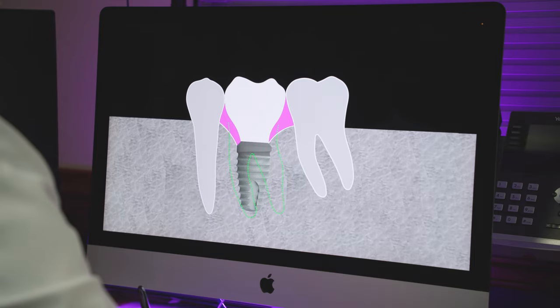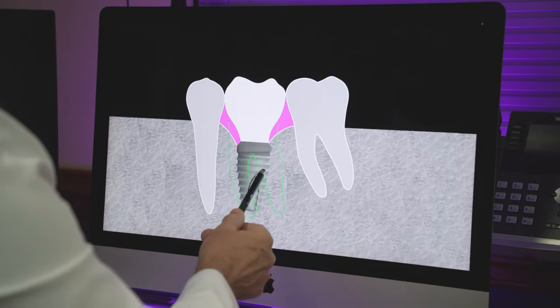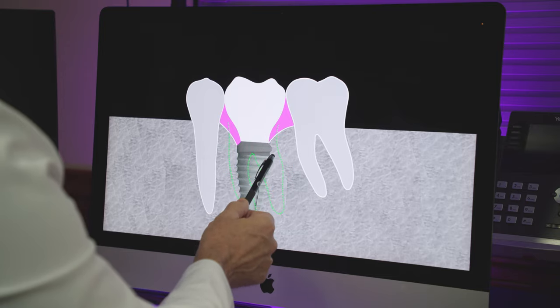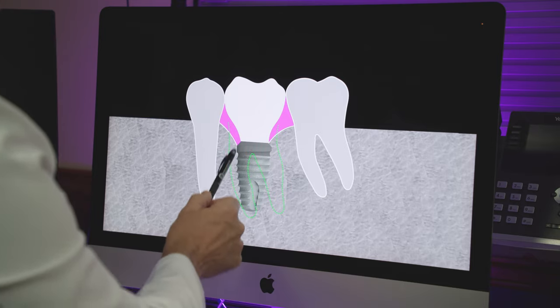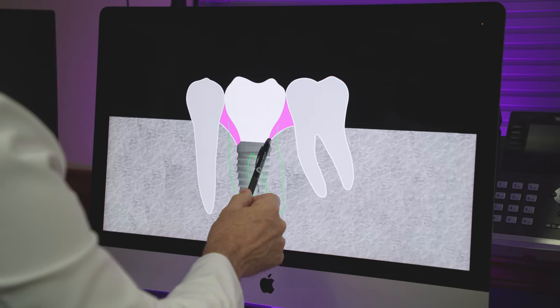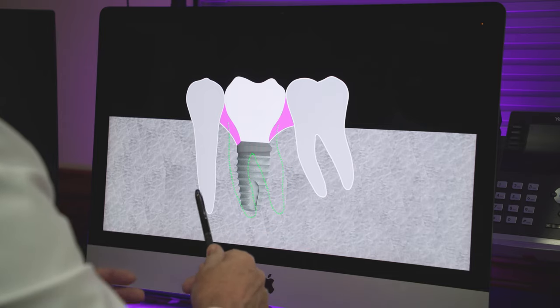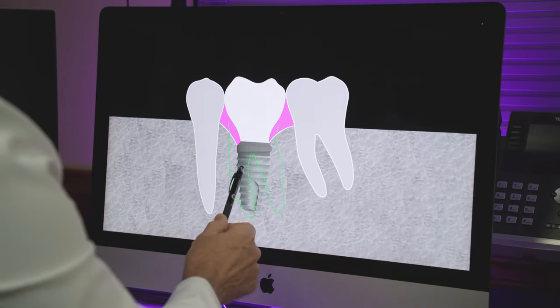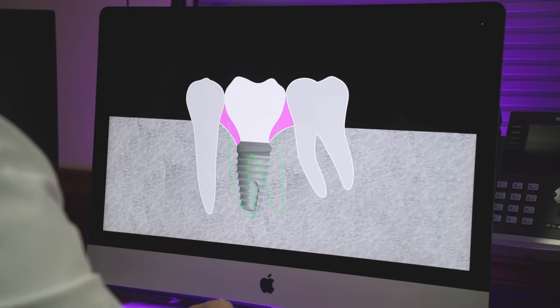Now, if we superimpose the original socket that the tooth went into, it would look like this with a green dotted line. This is very important: when we place this implant, this area had no bone because this was the socket. There was no bone here to start with — nor here, nor here. So the bone had to grow. If the bone grows and the outcome looks like the left or the right scenario, either way you don't have crestal bone loss, because there was no bone there in the first place. There was a tooth there. You took the tooth out, there was an air gap, and you grafted the gap. So calling this crestal bone loss is a little bit of a misnomer.